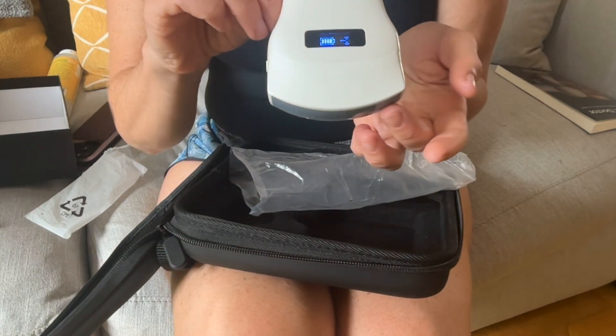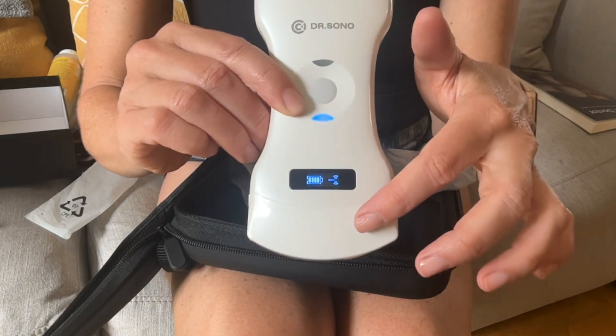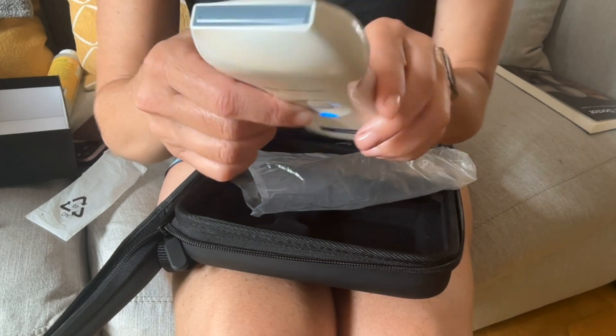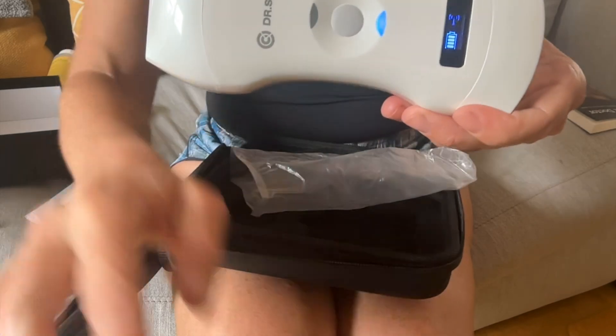Right now we are connected, as shown by this blue light, to the curvilinear probe compared to the flat linear probe here. That's the device, and then we'll work on using it.